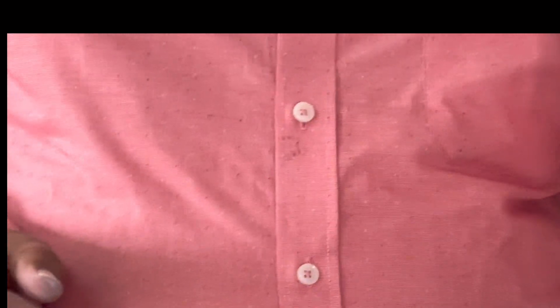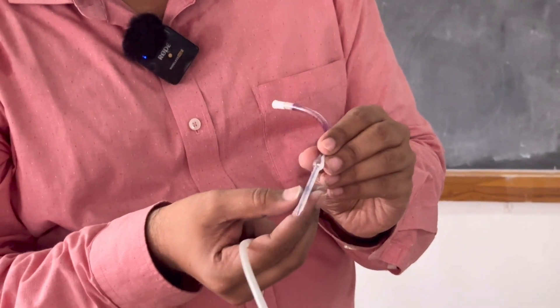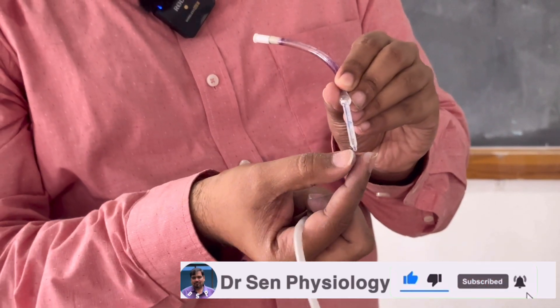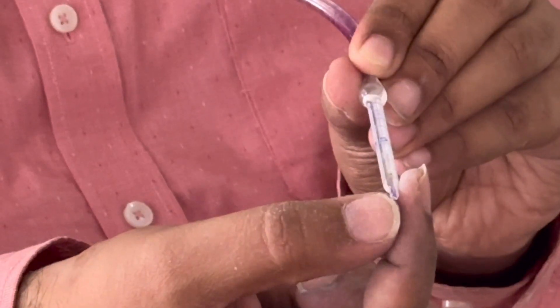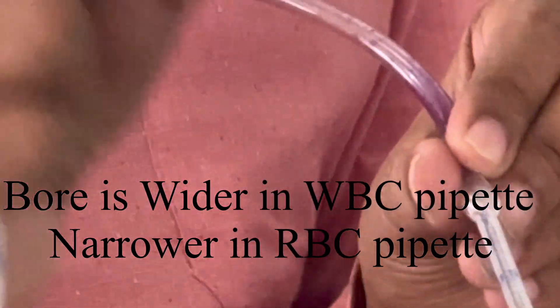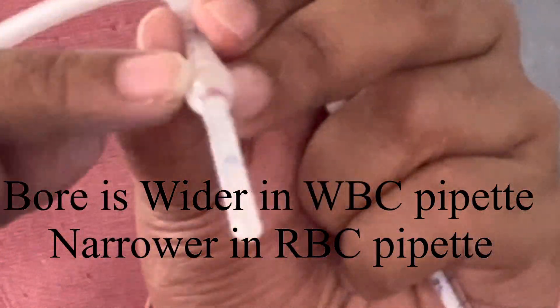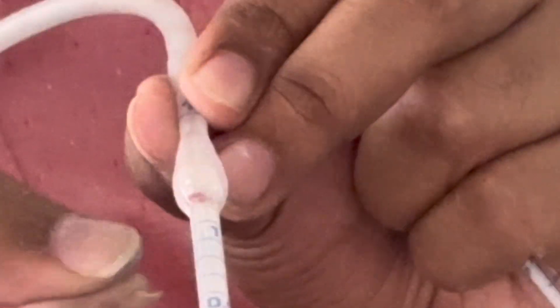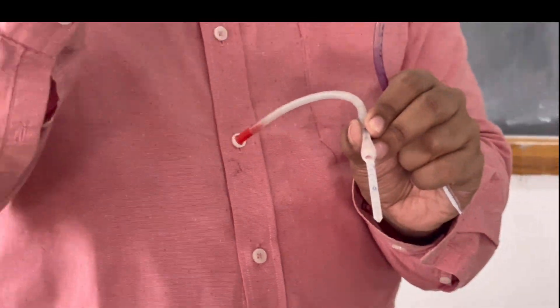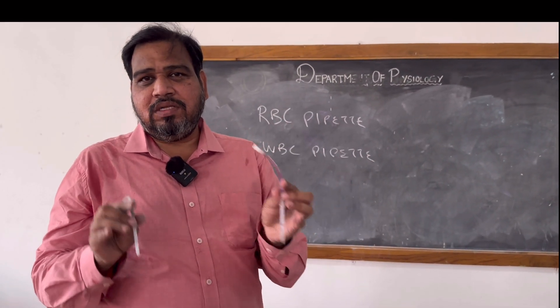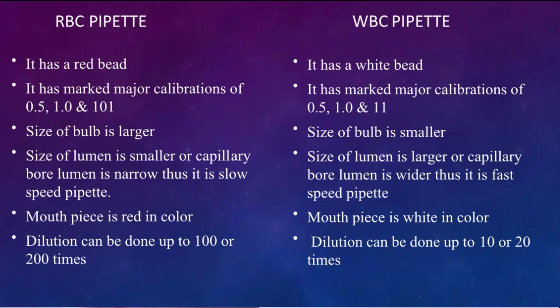Watch the pipette — you can clearly understand the bore, that is called bore, through which the blood enters. You can see the hole — this is wider in WBC pipette. Remember WW: Wide bore for WBC pipette, through which the blood is going to come. And for RBC pipette, the bore through which the blood comes is narrow. So WW — Wide bore for WBC — is the mnemonic you can remember. So these are the differences between RBC and WBC pipette.